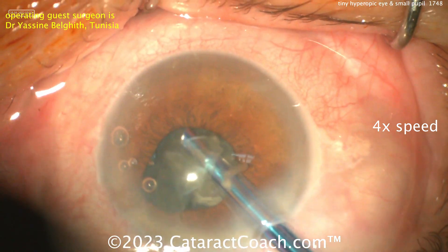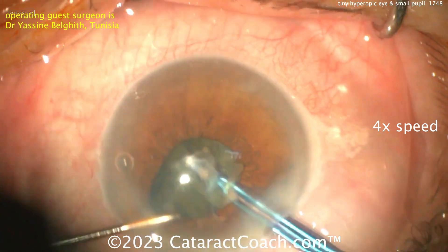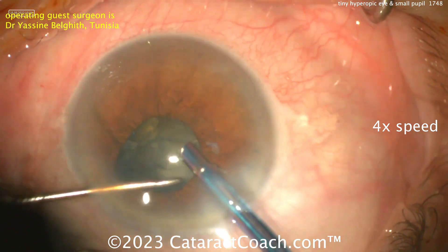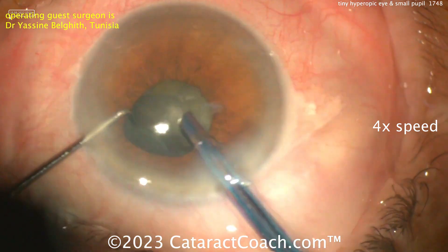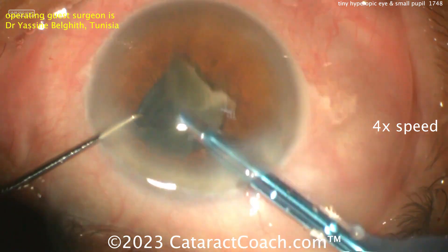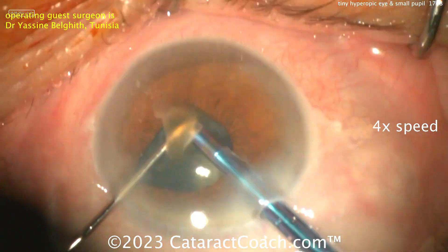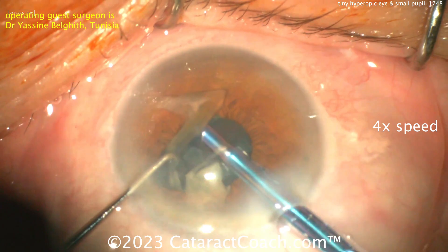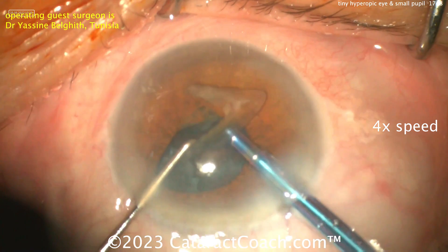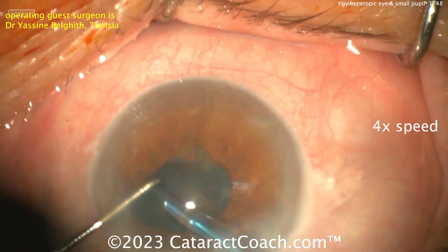More viscoelastic — smart move. Putting more viscoelastic in deepens the AC, protects the endothelium, and gives you more working room. Now look at that even tinier pupil. The care you have to take here is don't leave any pieces stuck underneath the iris. There was a little buzz of the iris inferiorly — that's okay, no major consequence — but now that the iris has been buzzed a bit, it's going to come down even more.